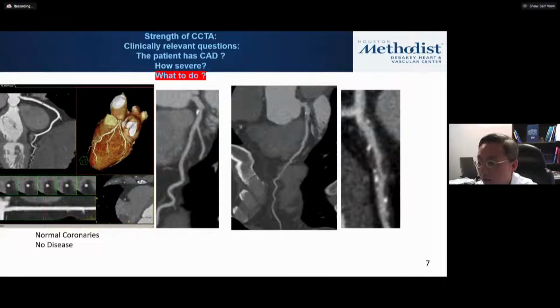In this case, I think it helps at least to exclude significant proximal disease of hemodynamic significance. And the distal RCA with abnormal FFR, we can argue if it's real or not, but basically, with this information, the patient was able to be managed medically, and 1 month later, he finally feels completely asymptomatic, doing quite well, going back to exercise. So I'll highlight the use of coronary CTA for management of patients with suspected CAD.